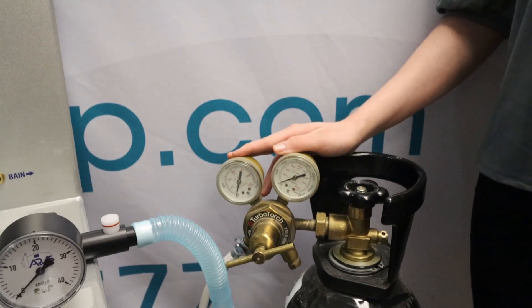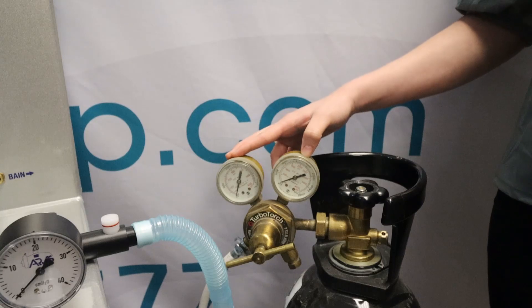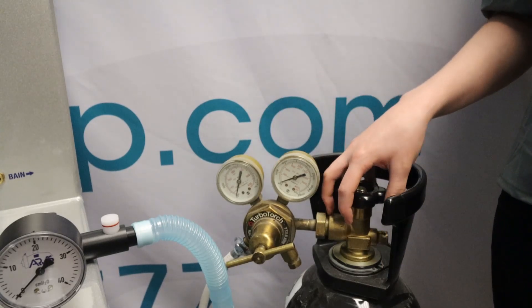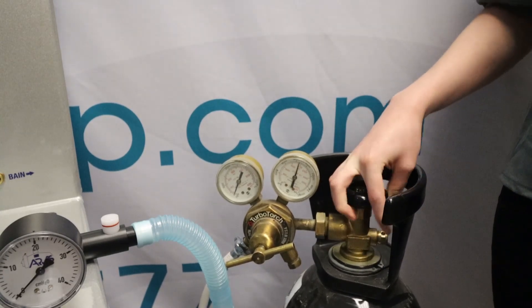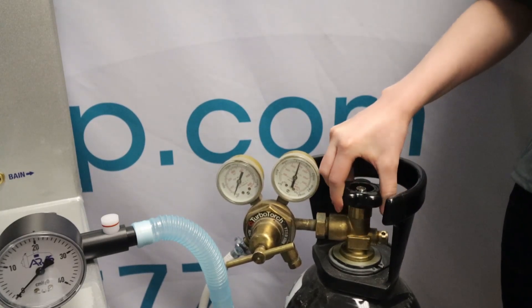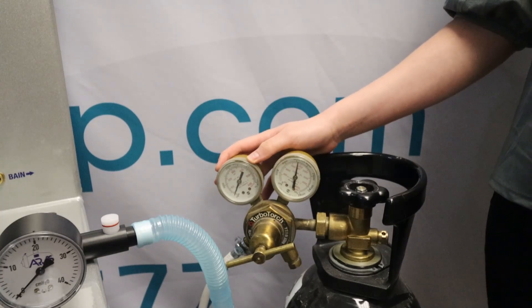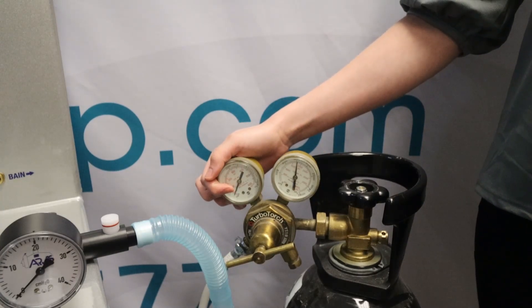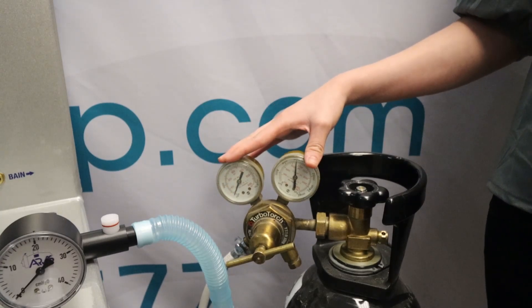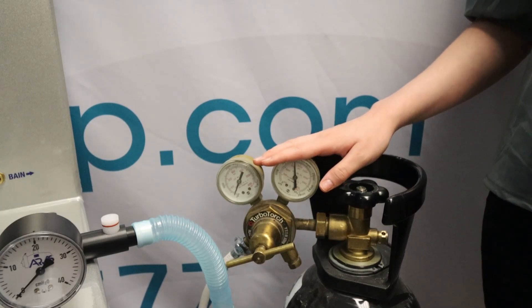If your oxygen pressure regulator is equipped with two gauges, you'll be able to leak test your oxygen delivery lines. To do this, open the bottle valve and pressurize the lines to the preset pressure, then close the valve. Now observe the pressure gauge after 30 minutes — it should still read approximately 50 psi. If the gauge remains steady at 50 psi, you can be confident that your supply lines and fittings are not leaking.